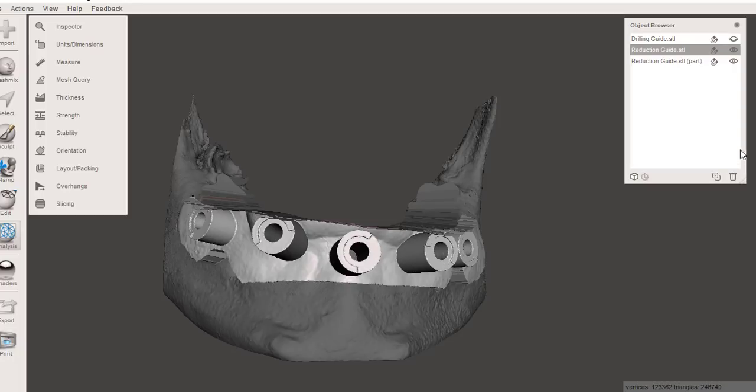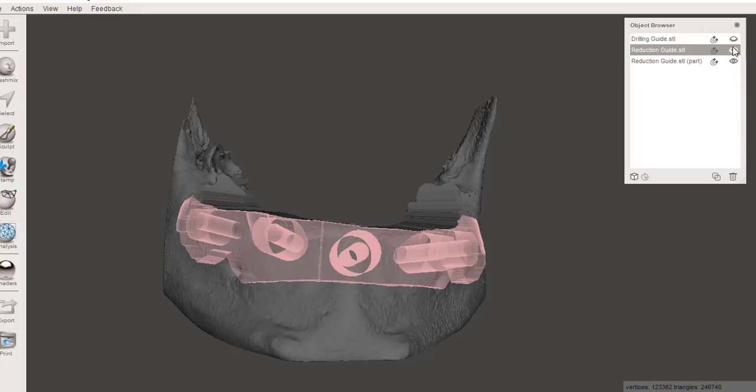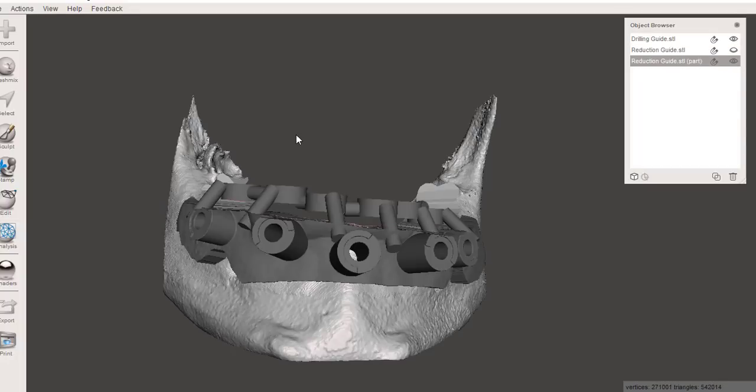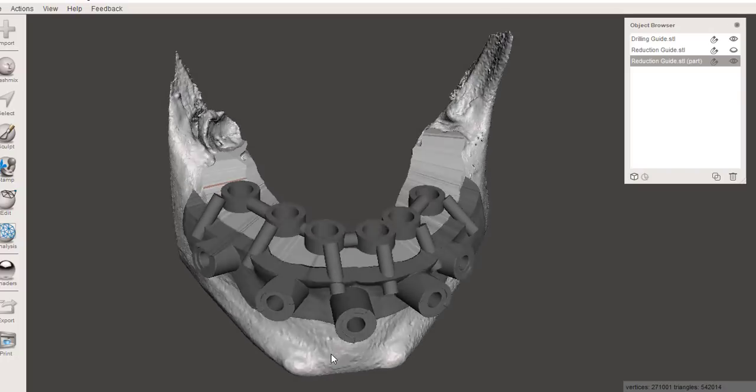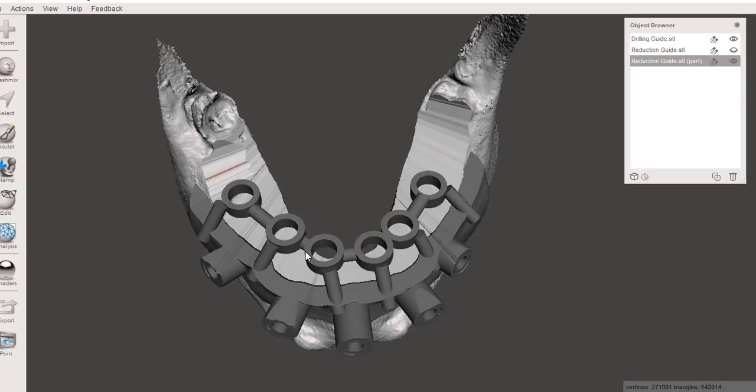Okay? Once you've done that, take this one out and put in your drilling guide. Because they are one and the same file, as far as this part, it's going to fit the exact same way. Pins will go into the same place, and you'll be able to now do your drilling. So these tubes, remember, are set up to accommodate the Blue Sky Fully Guided kit or whatever kit you want to use.